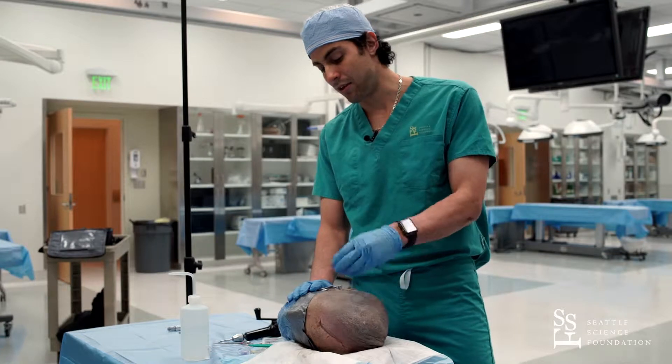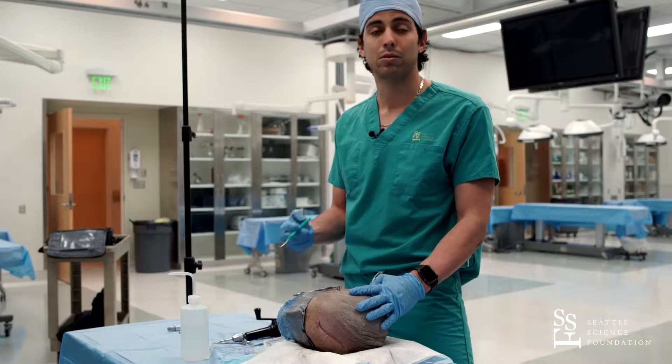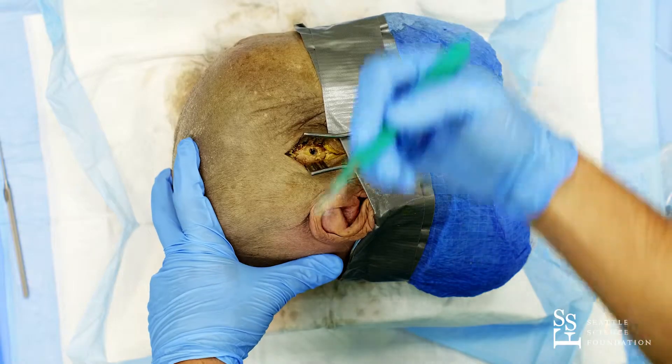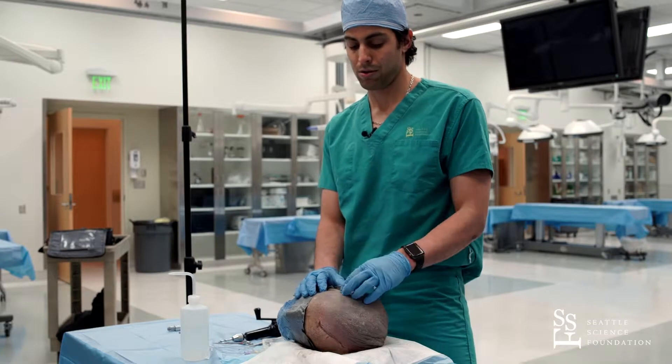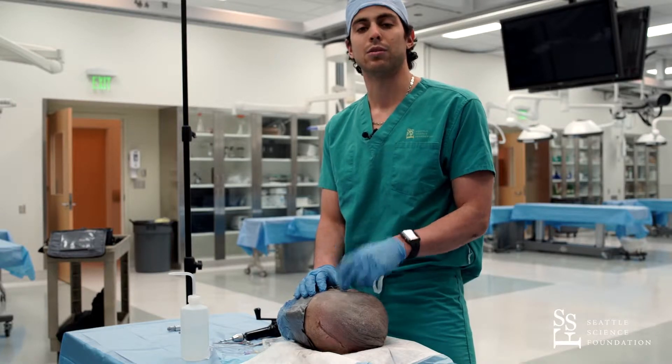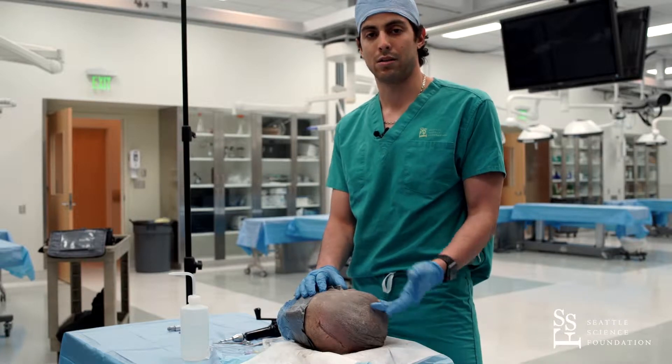If you don't see any bleeding or blood clot, you will continue doing the subsequent burr holes. The next burr hole will be on the contralateral temporal bone.